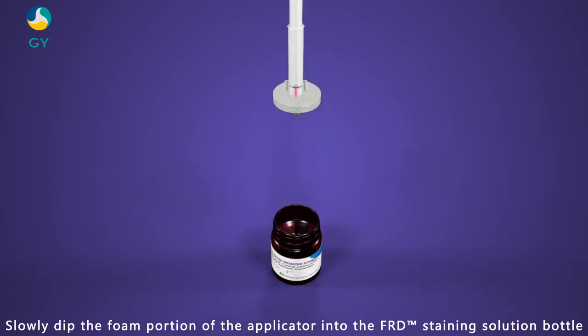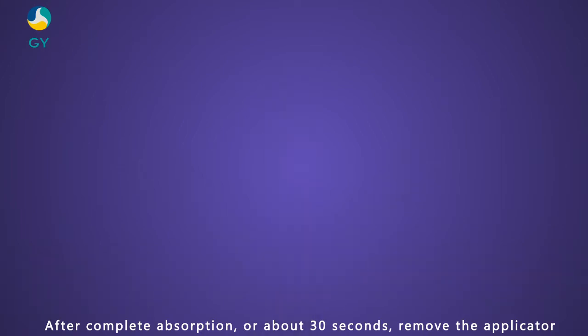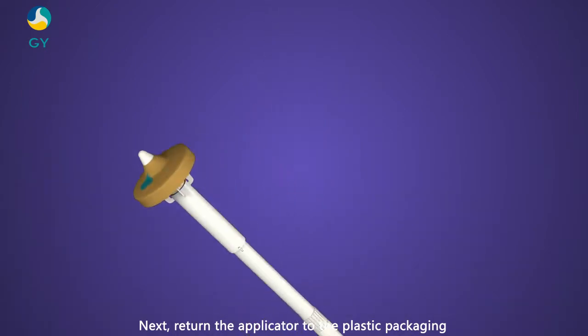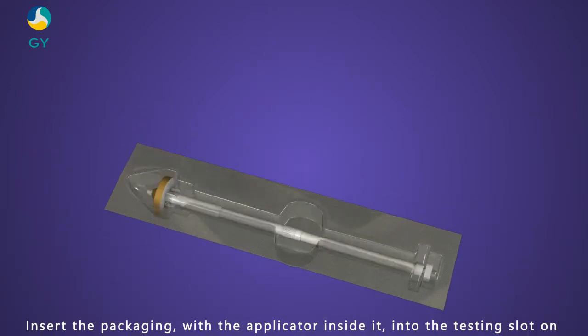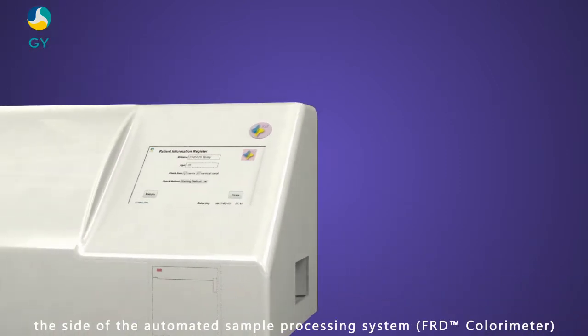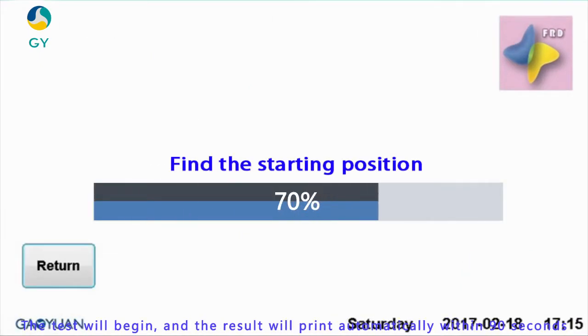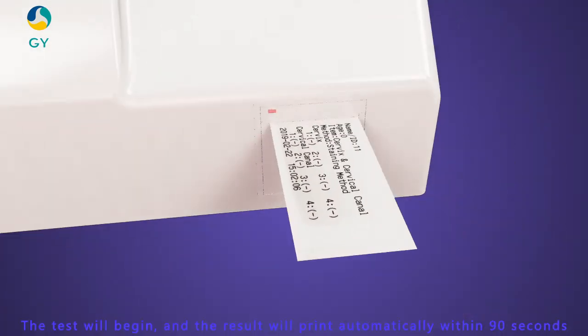Slowly dip the foam portion of the applicator into the FRD staining solution bottle. After complete absorption, or about 30 seconds, remove the applicator. Next, return the applicator to the plastic packaging. Insert the packaging with the applicator inside it into the testing slot on the side of the automated sample processing system. Enter the patient's information and click the Scan button. The test will begin and the result will print automatically within 90 seconds.